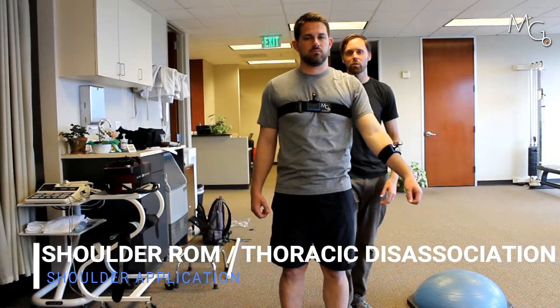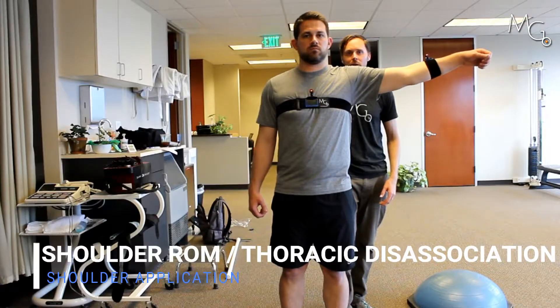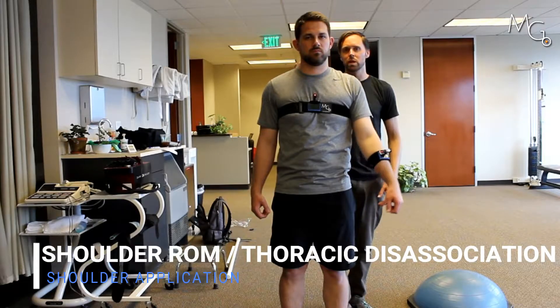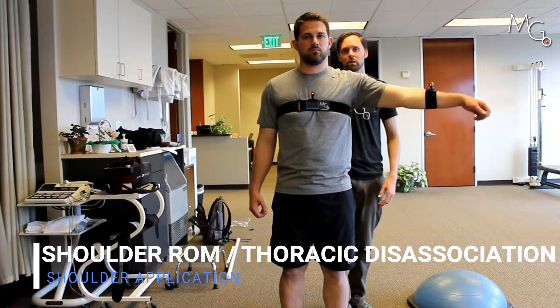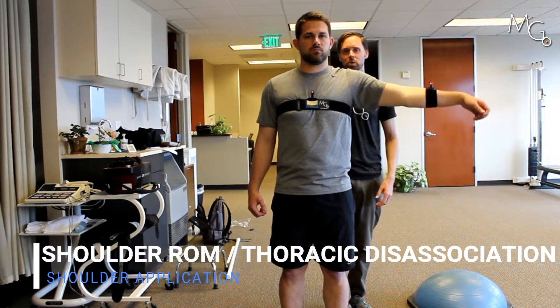Move your arm even a little further so you can project the laser beyond the center target. This is going to monitor how much Chris is rotating through the thoracic — and that's a pretty cool additional cue for your patient.